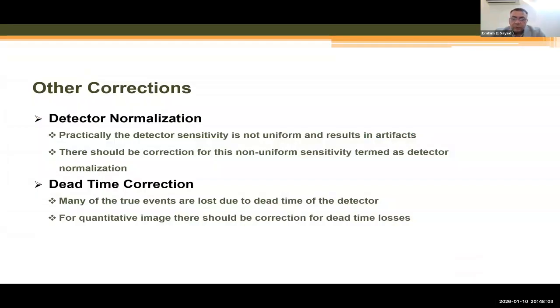Different optical paths, so we can have some variation in the optical path of the light inside the crystal. Also the electronics have different gains. It's electronics, so it can vary with electricity easily. So the image without normalization gives an artifact called bullseye or a ring artifact, as we know. These artifacts obscure real pathology, actually.